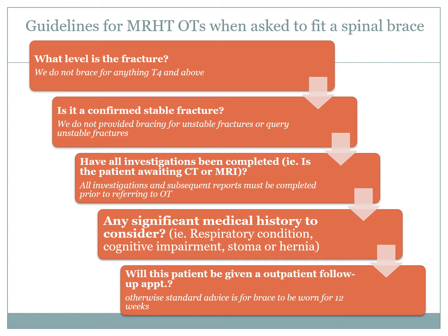We review the patient's medical history to see if there is anything significant that may impact fitting of the brace, such as a respiratory condition, a cognitive impairment, a stoma or hernia. And finally, we check if the patient has been given an outpatient follow-up appointment by orthopedics.